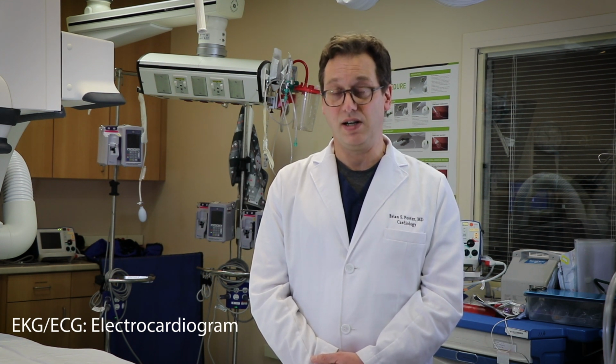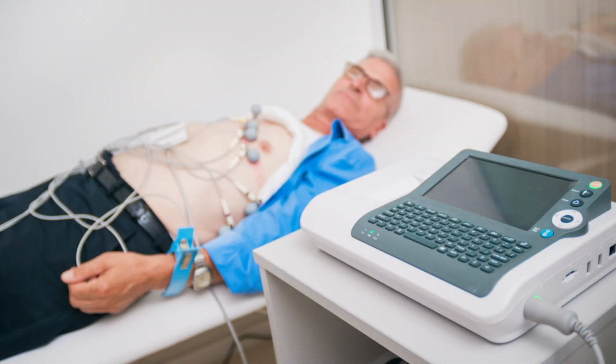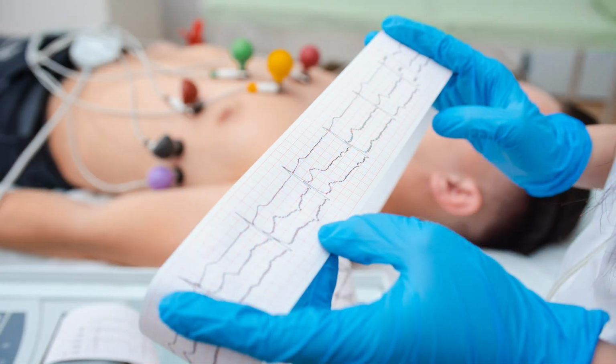The first test that I wanted to mention briefly is something called an EKG, also known as an ECG for short. You may be familiar with this already. It's a very common test that's done both in cardiology offices as well as family practice and internal medicine offices. And that's simply a 10-second snapshot of the heart's electrical system. In a test like that, you just lay on a bed. There's a series of stickers that are put on your body, and a map of the heart's electrical system is created. And that's very useful for folks like myself to try to understand what might be wrong with the heart's electrical system. It's a very good test, but it really only captures about 10 seconds of time.